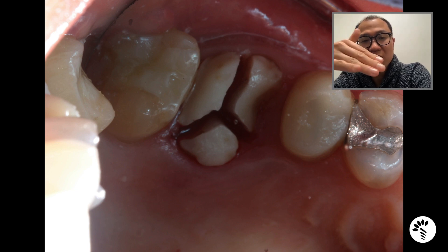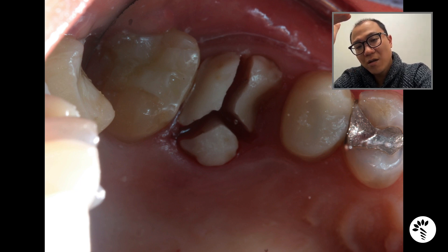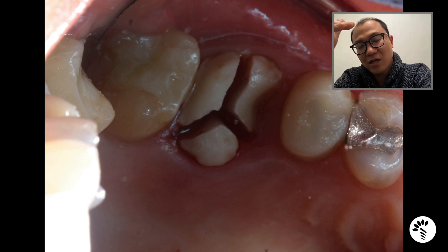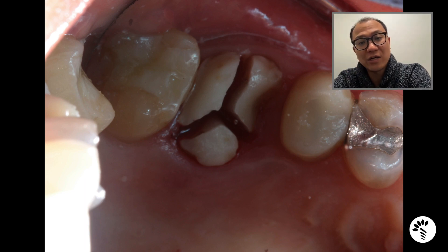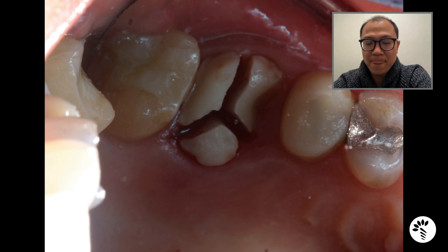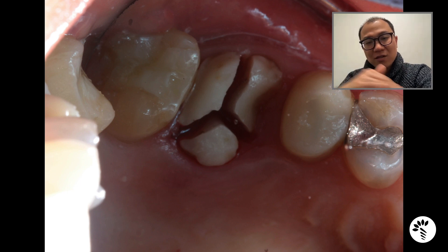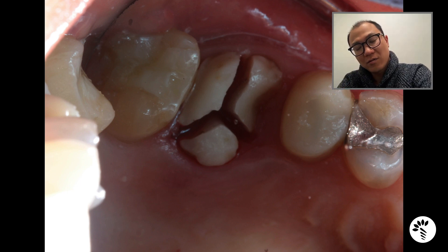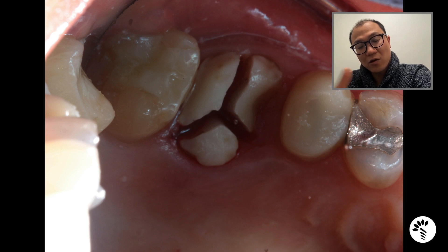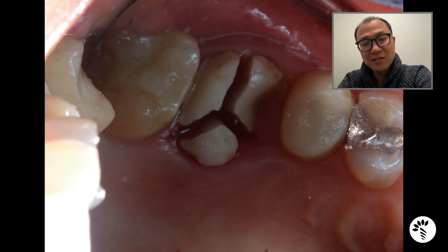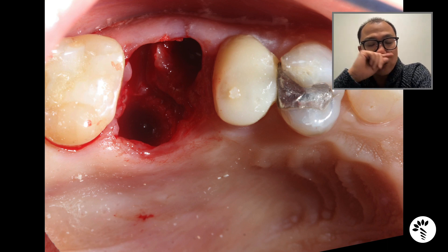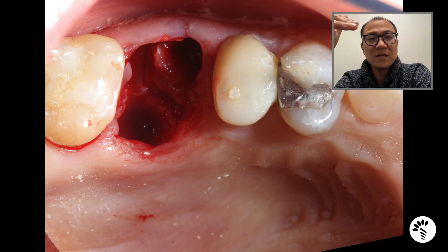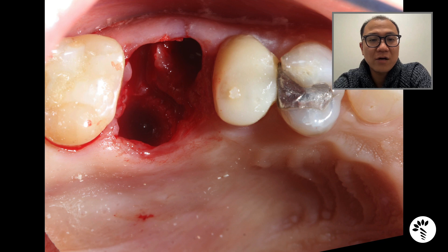Remember, the interproximal furcations on the maxillary molars are palatal to the interproximal contact. So when sectioning interproximally, your extent needs to go palatally — from a close view it should look like a Y-shape, not a T-shape. After sectioning the tooth, I check that I've sectioned all the way to the bone, then I start elevating, and the tooth is extracted atraumatically. You can see I preserved the integrity of the bone.